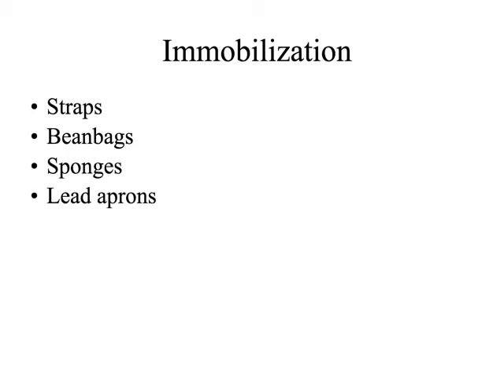You're going to have to use 2 lead aprons, right? One for the table and one for the patient, because you're spinning around them while you're taking x-rays. There's no reason to put shielding on just one side. And I think a lot of the Baptist facilities use something with less attenuation value than lead over the patient's eyes or breasts, for female patients. Those are good things too. They also just serve as reminders.